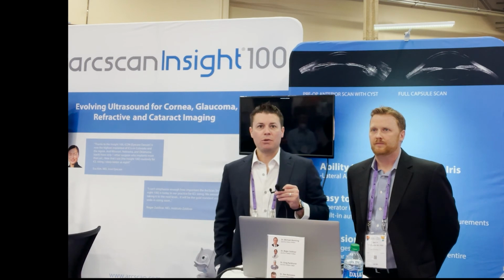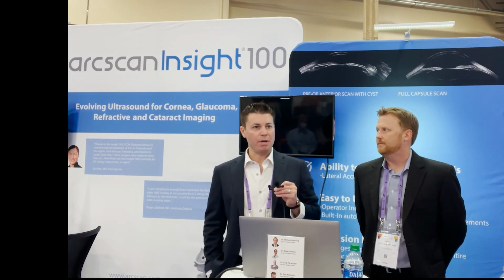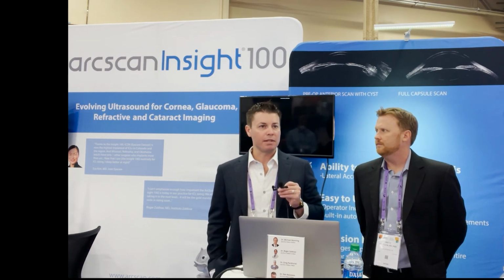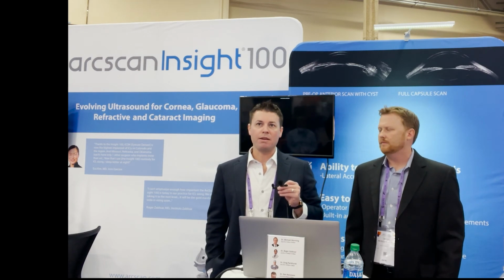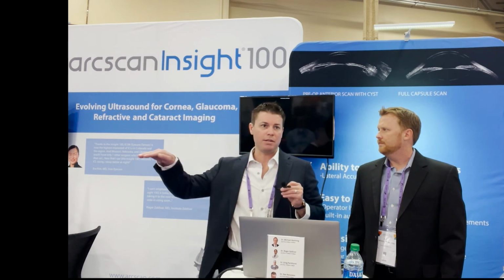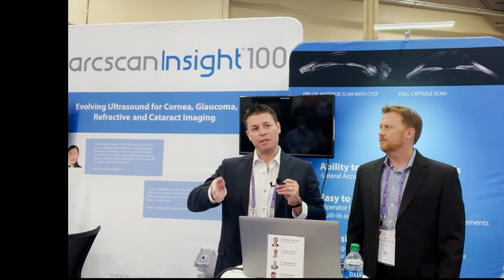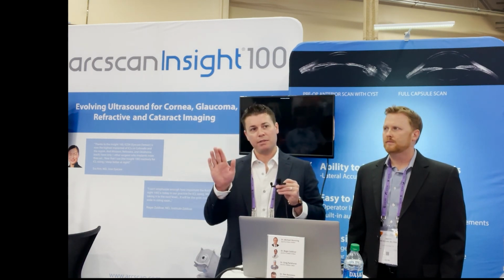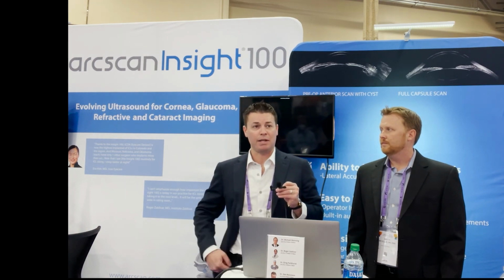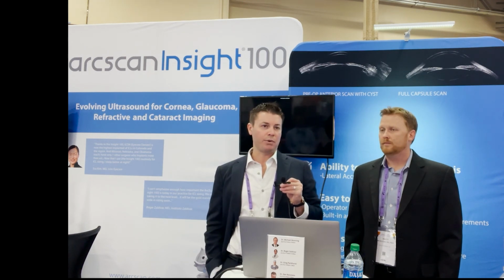I wouldn't say that it's super common that a cyst will change our surgical management, but it happens occasionally. Maybe once or twice a year we find a cyst that's there. I have had a couple of patients in the past where a large cyst in the 180-degree meridian would cause me to decide to implant the ICL vertically instead of horizontally to avoid the cyst. Now, of course, you can't do that with toric ICLs because you got to put it in a very particular place, but with a spherical ICL, sometimes a large cyst may cause us to alter where we put the lens.